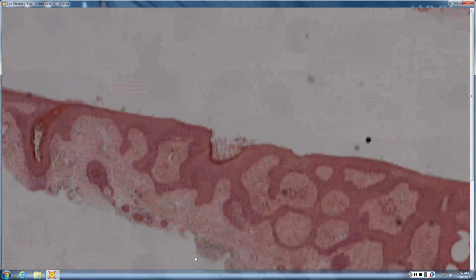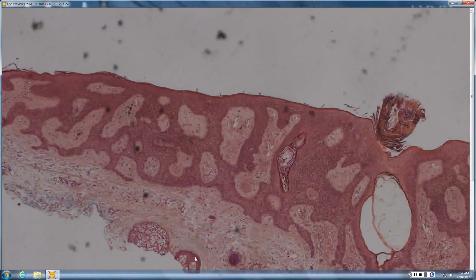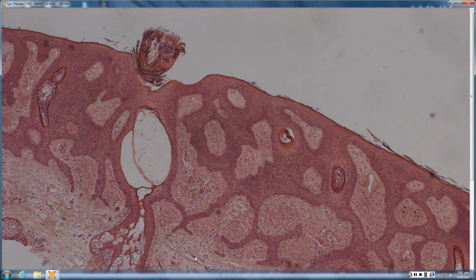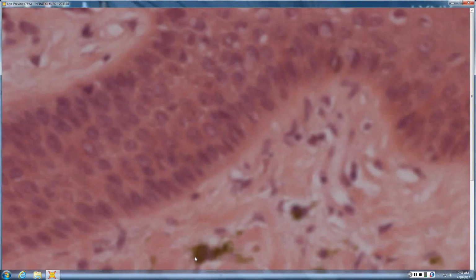Shave biopsies and reticular acanthosis. Think about a reticulated seb. There's no atypia. You have horn cysts. You have keratinocytes about the size of acrosyringeal keratinocytes, about half the size of normal keratinocytes. But then you have all this pigment incontinence, and it's outlining pink chunks.